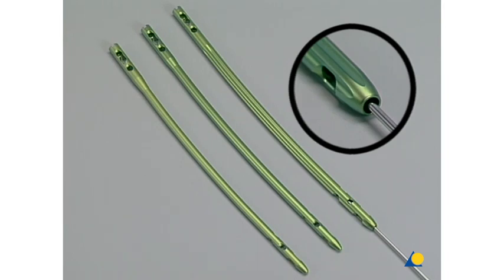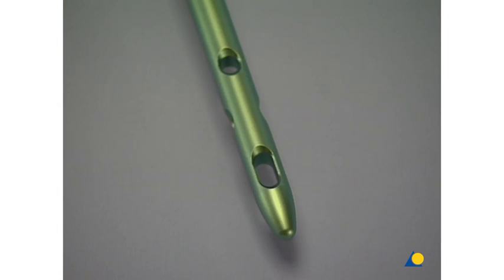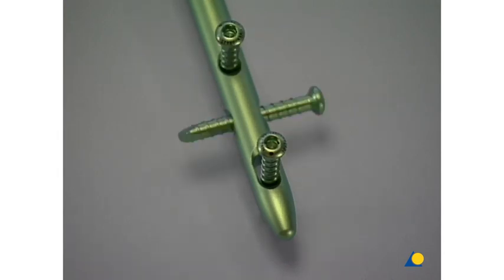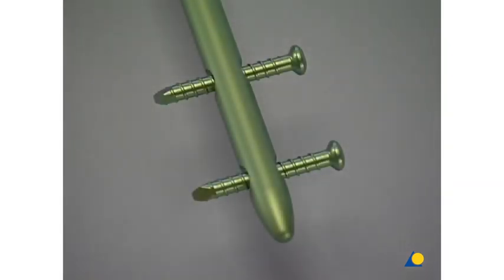Proximal locking is usually performed using 4.9 mm self-tapping bolts. The longer nails may be locked dynamically through an oval hole in the anteroposterior direction, and or statically through a hole in the AP direction, and or through a second static hole in the lateral medial direction. The shorter nails are locked proximally through static holes with two 4.9 mm bolts, placed in the lateral to medial direction.